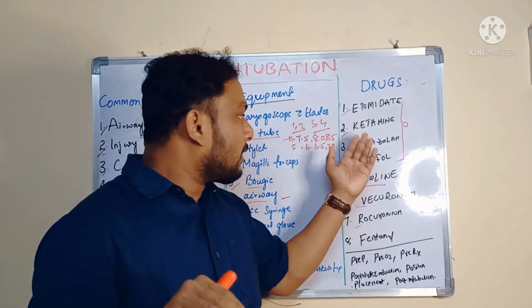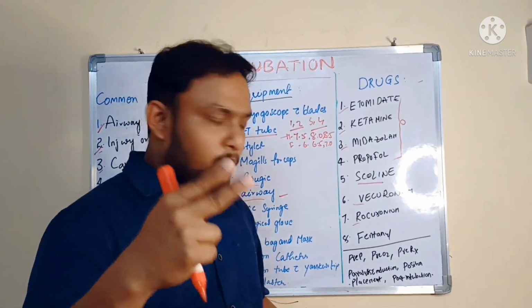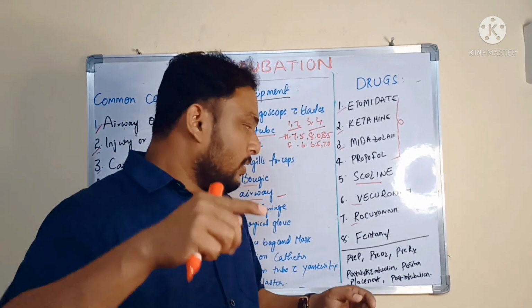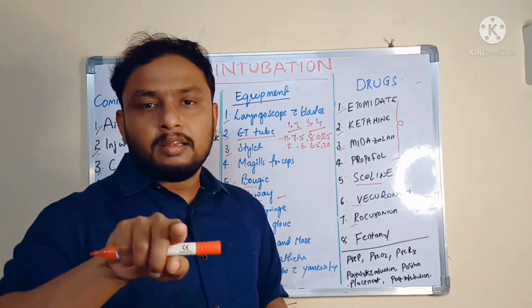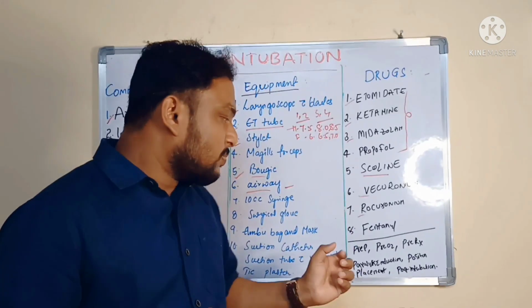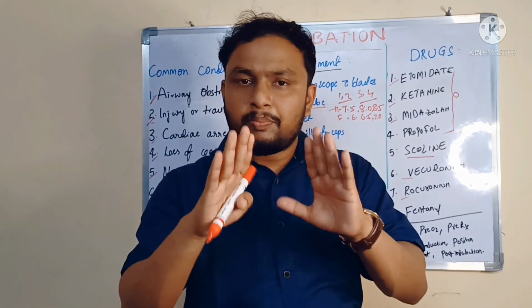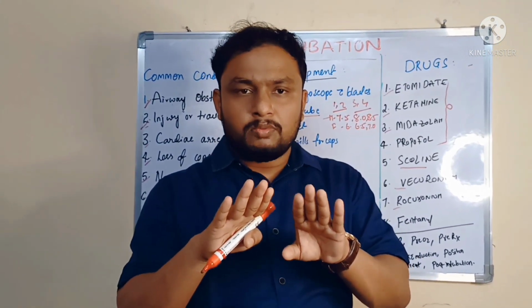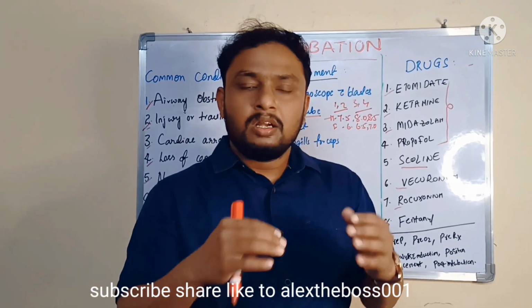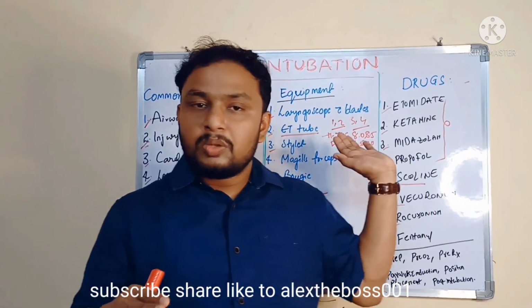In this stage we will sedate the patient and keep them ready. Oxygenation will be given for a continuous 2 minutes, and for induction we will sedate the patient within 1 minute. Then you do the intubation, and check the position and placement. Next, post-intubation: keep the patient in a sedative state, to reduce the anxiety level of the patient and to reduce the pain. So these are all the stages of intubation.